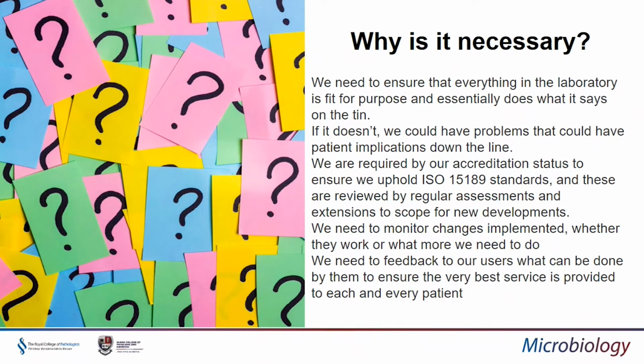So why is it necessary? We need to ensure that everything in the laboratory is fit for purpose and essentially does what it says on the tin. If it doesn't, we could have problems that could implicate patient management further down the line. And we are required by our accreditation status to ensure we uphold the ISO 15189 standards. This is the international standards for quality, and these are reviewed regularly by assessors.